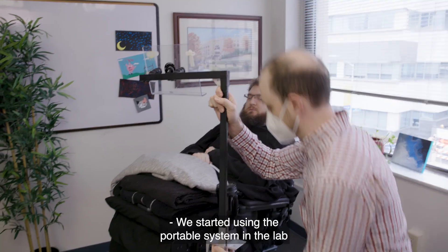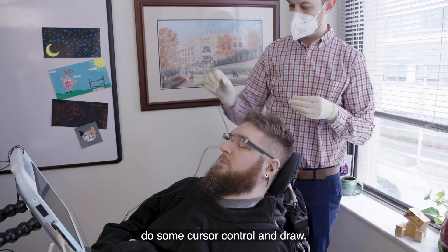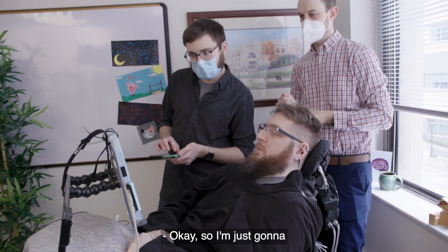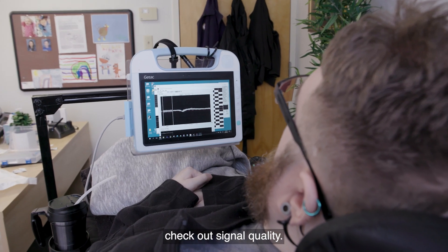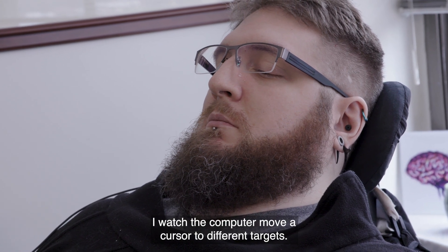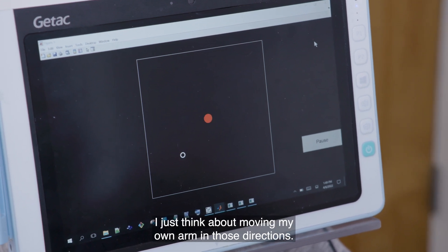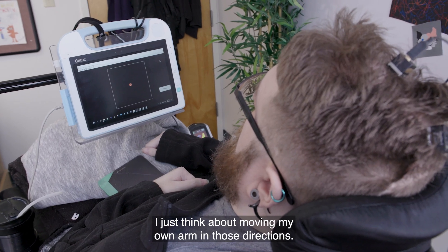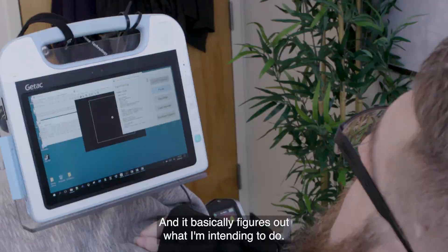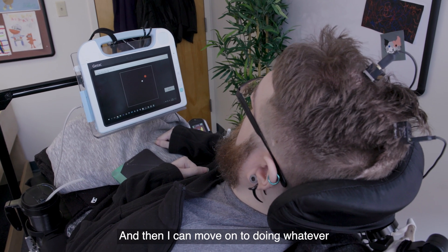We started using the portable system in the lab a few years ago. First we check signal quality, then to train a decoder I watch the computer move a cursor to different targets. When it's moving to those targets, I just think about moving my own arm in those directions. It looks at the neural signals when I'm thinking about those movements and basically figures out what I'm intending to do.